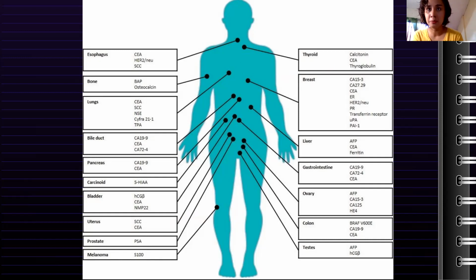If you have antibodies that are specific to these tumor markers, then you could use them for immunohistochemistry. So, I want you to familiarize yourself. My teacher said CA199, the 99 looks like an isaw, so it looks like colon. So, gastrointestinal, colon, the digestive tract. I want you to familiarize yourself. I might just ask a few of the basics.